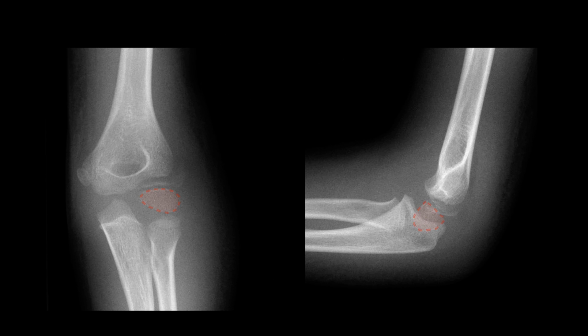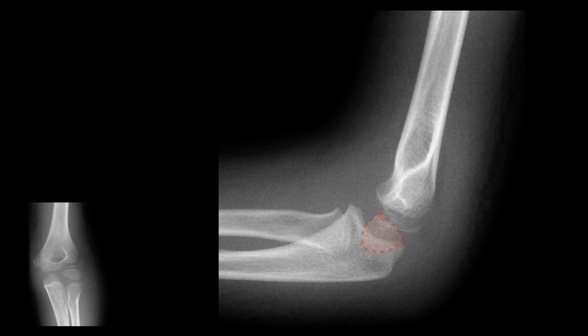Let's look at a case. The capitellum, radial head, internal epicondyle and the trochlea are ossifying. There is an elevated posterior fat pad indicative of an elbow effusion and a fracture through the lateral condyle. On the lateral view we can draw in our capitellum followed by the radial head and neck and the radiocapitellar line. The line intersects the capitellum and there is therefore no dislocation despite the lateral condylar fracture.